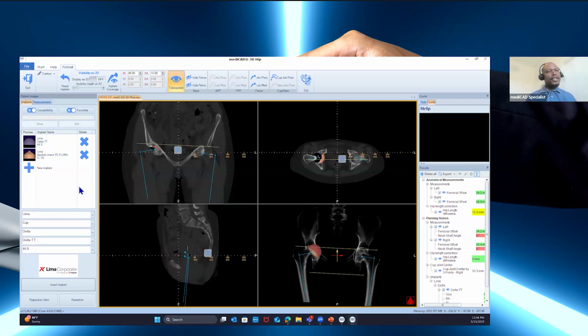And our sole focus, our main product, is preoperative and postoperative planning. So that's our sole focus. Because a lot of times, I know some of you have access to planning that is included with the templating company or the pack company you work with, which normally includes something basic just to gain your business. But for mediCAD, planning is our business, right? So we work with expert surgeons to make sure that everything we do is based on expertise.